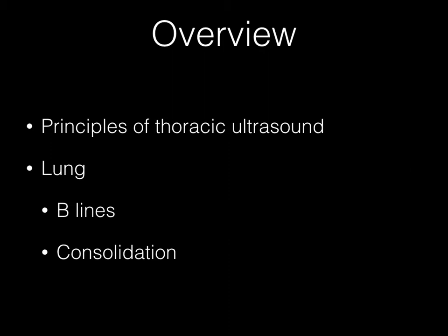Hi, this is Dave Kirshner, and today we're talking about lung or thoracic ultrasound. Now, in terms of an overview, we're going to be jumping all over the place, but mostly by the end of this, we want to talk about some principles of thoracic ultrasound, as well as how we're going to look at the actual lungs and what we're looking for.